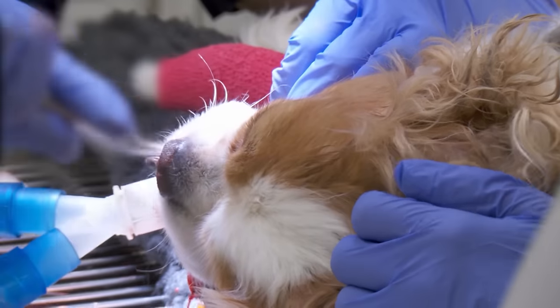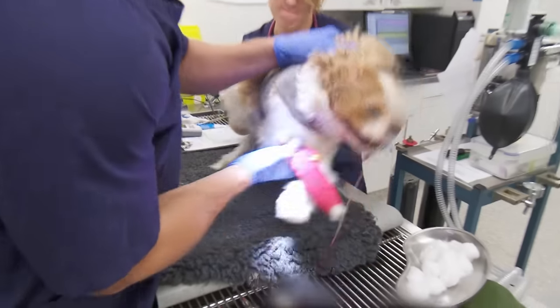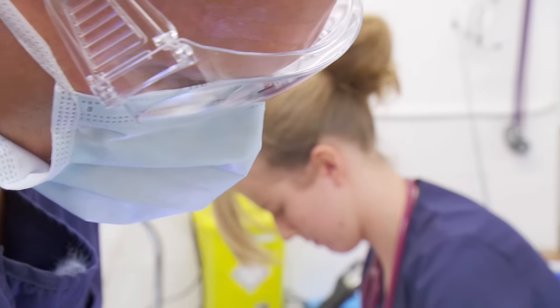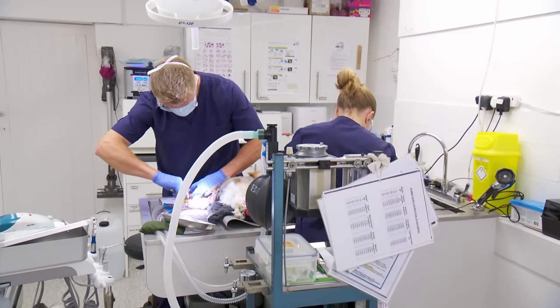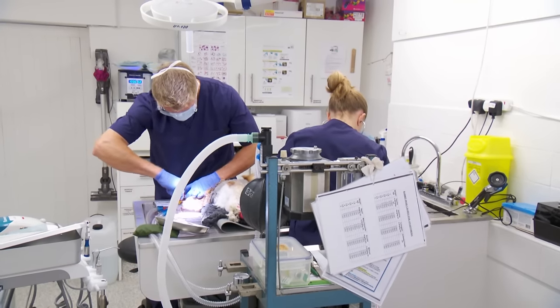The motto for teeth is, if in doubt, pull it out. So legs underneath, 1, 2, 3, and over. Good boy. Good boy. Right. I had to take quite a few out. I'm going to have to count the ones I've left in rather than the ones I pulled out soon. Some of them are just falling out. Yeah, some of these teeth are really pretty bad, hardly having to pull them at all.